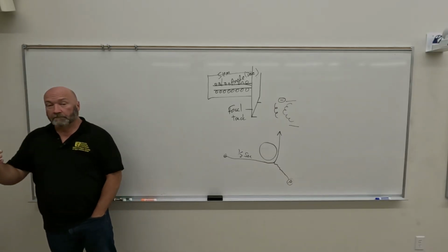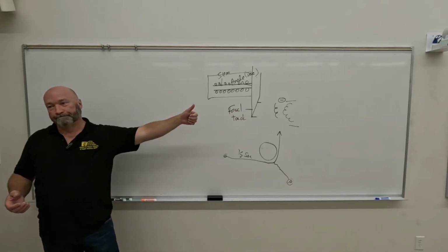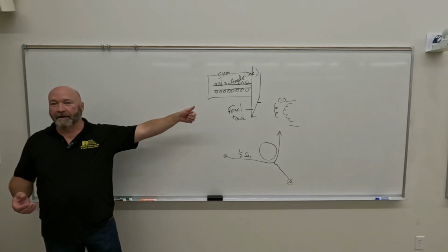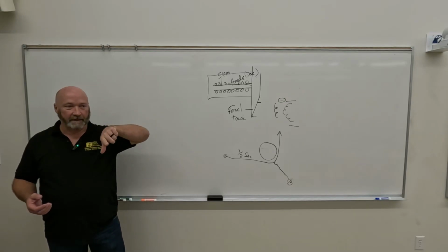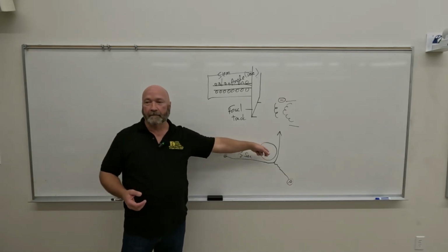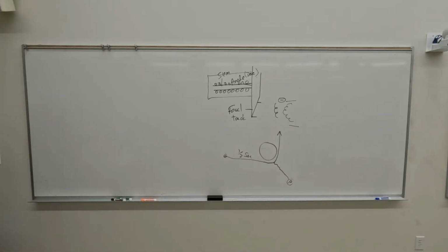So gold would make a better target, right? It would melt. That's the problem, it couldn't handle what tungsten could handle. Would it be better from an atomic number standpoint? Yes, absolutely. Now, look over from gold, 1, 2, 3 places. What do you run into?